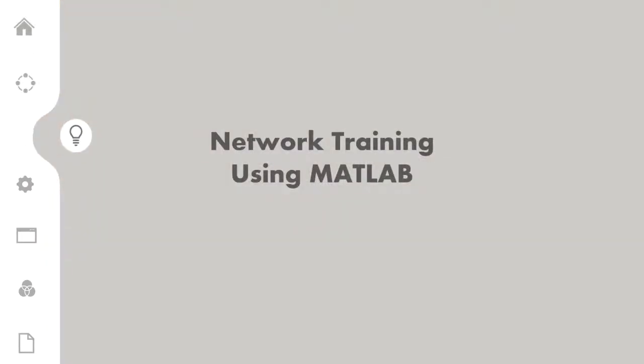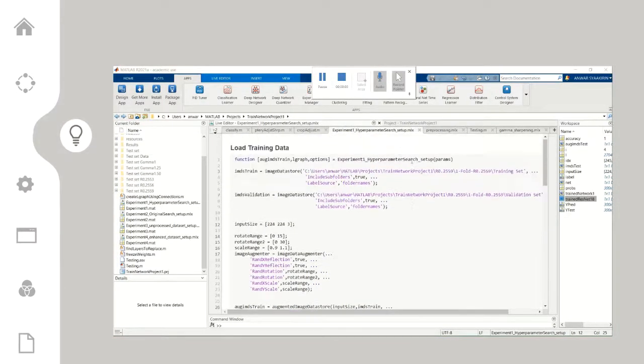Let's see the network training using MATLAB. For network training, this is the code that I use to train a deep learning model. First of all, we insert the dataset into MATLAB. Since the model we use to train on is ResNet18, the images in the datasets need to be resized into 224 in width and 224 in length. After that, the images undergo the augmentation process. The augmentation process is purposely to extend the small dataset that we have to prevent overfitting.